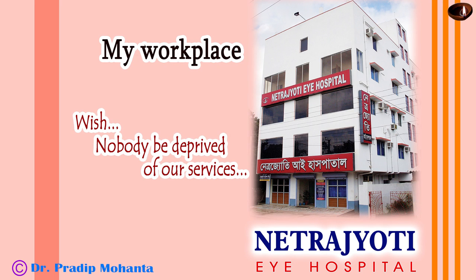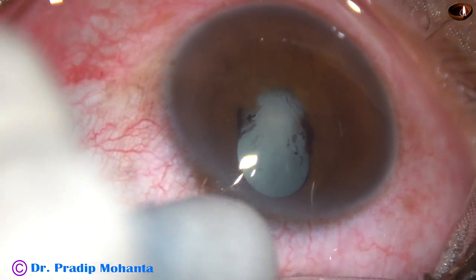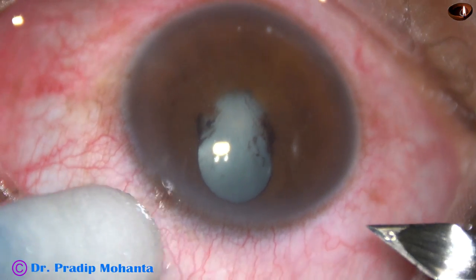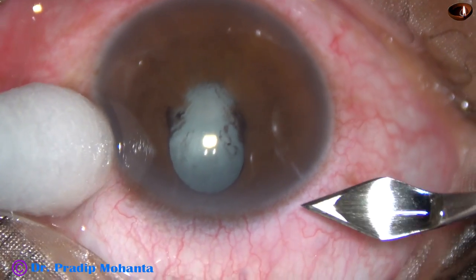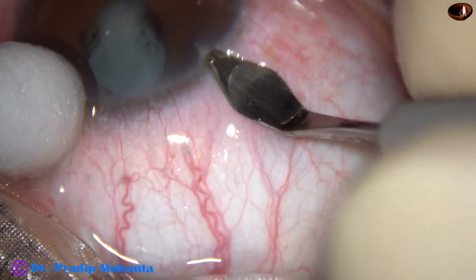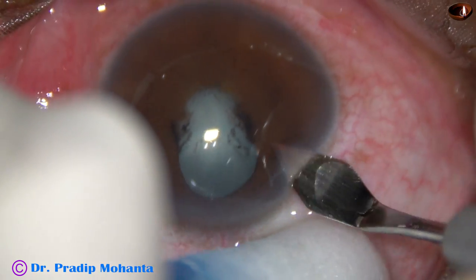Friends, welcome to my workplace at Ranaghat, West Bengal, India. This is a cataract with posterior synechiae from 2 o'clock to 10 o'clock — so 8 clock hours of posterior synechiae — and there is a fibrous band in this area along the pupillary border.